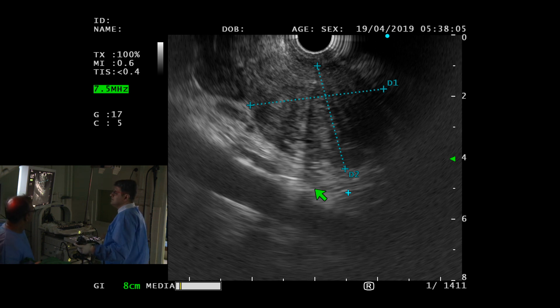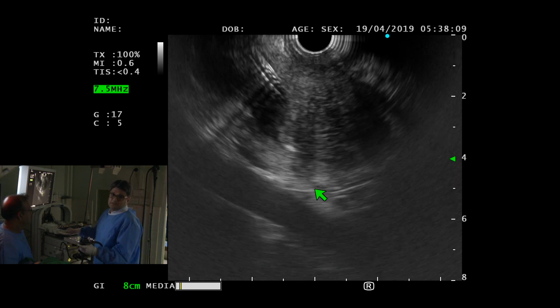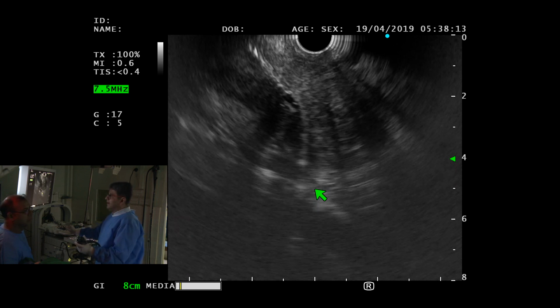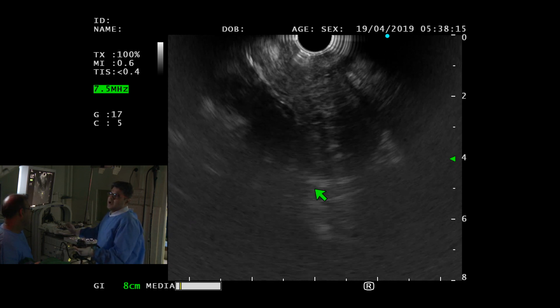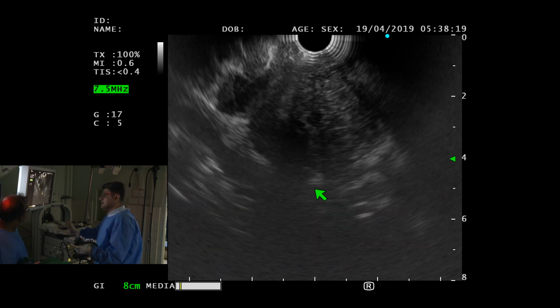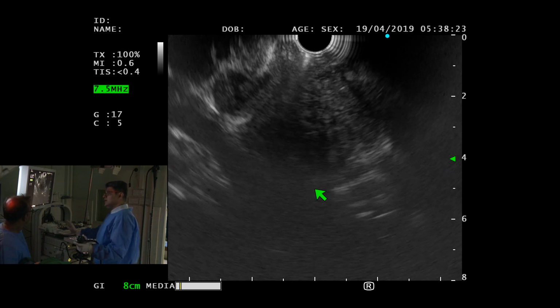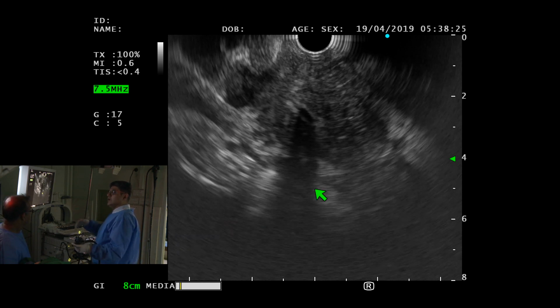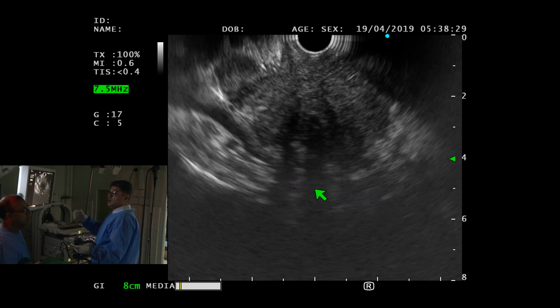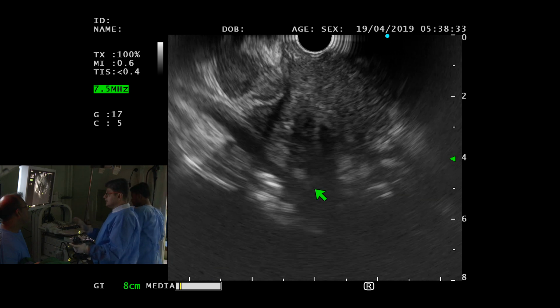So it's a decent mass, 4.5 by 3.5. Now when we report an EUS, I think the first heading is the background. In the background, I'll encourage trainees to write exactly the case as presented, in just 1 or 2 lines. You don't have to write huge amounts. So: 45-year-old, recurrent pancreatitis and a CBD stricture. CT showed no mass, for EUS assessment. End of. Nothing more than what's needed.